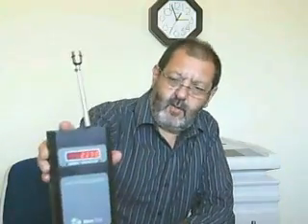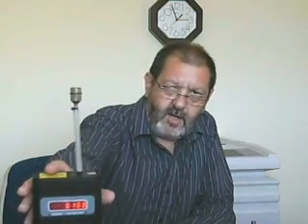Today we're going to demonstrate how HEPA air purifiers are used to assist hospital infection prevention and control departments. To that end, I'm going to demonstrate the changing particles in this room with the air purifier running. I'm just going to set the particle counter going now while we have a little bit of discussion on what we're about to do.